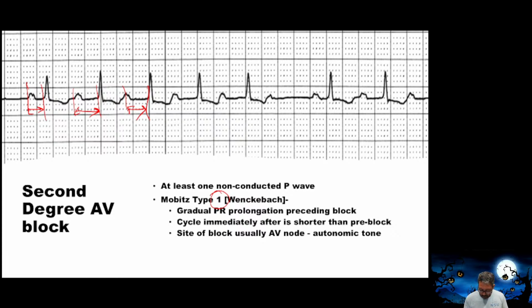And eventually, we drop a beat. I'm sorry, yeah. Lengthen, and then we drop it. Now it kind of goes back to normal almost. And look at the next beat. It's already lengthening out again.